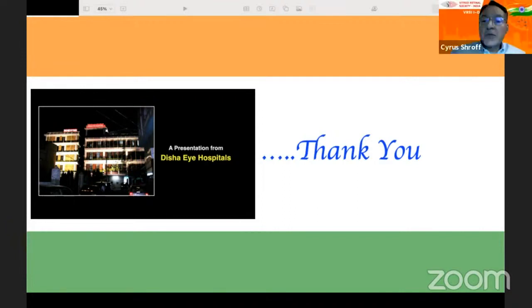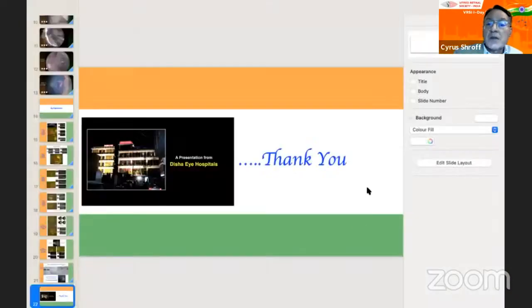Anand, can I make an observation? Yes, please go ahead. Someday when we're talking about the gauge, I was just mentioning some of these cases, the blood is so dense and thick, and also the membrane, sometimes the CNVM is so tough that in these cases, sometimes we prefer to use 23 rather than 25, just because the 25 tends to keep getting blocked. So in these cases specifically, we say, let's use 23 rather than 25.